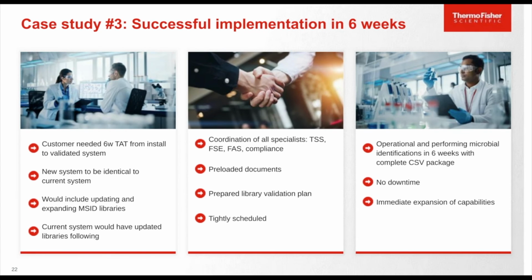We took preloaded documents, the documents that you just went through in your last slide, Darryl, and used the ones that had been completed for the previous instrument that we loaded for the customer and set those up for the new system. We prepared a specialized plan for how we could validate the new library for the customer, and then we put together the tightest schedule we possibly could.